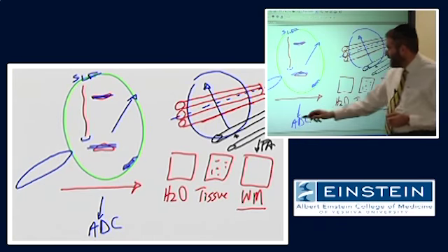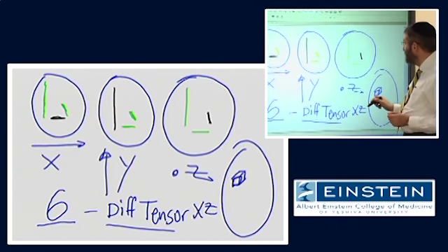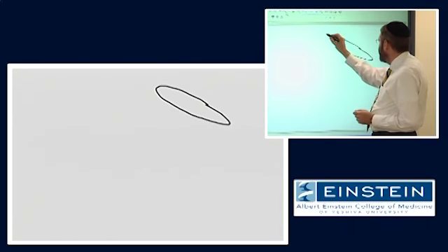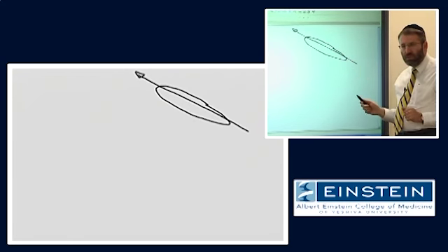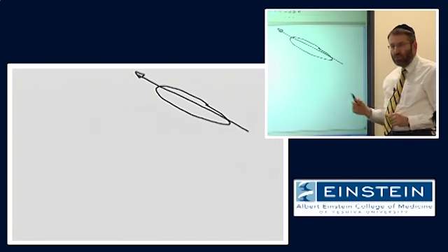if we think about this principal diffusion direction information, for each and every voxel, we can compute the diffusion ellipsoid and determine the orientation of the overall diffusion at that location.